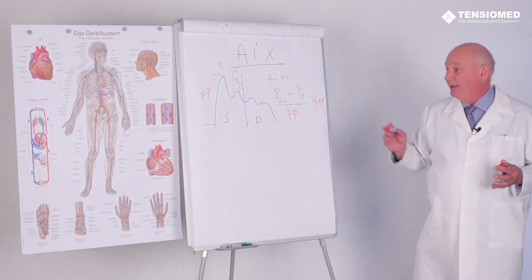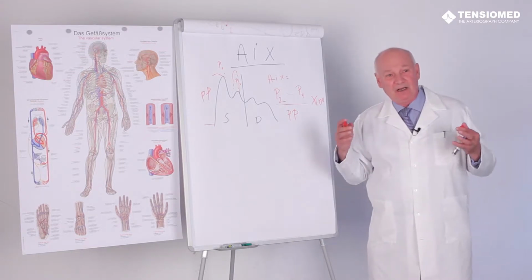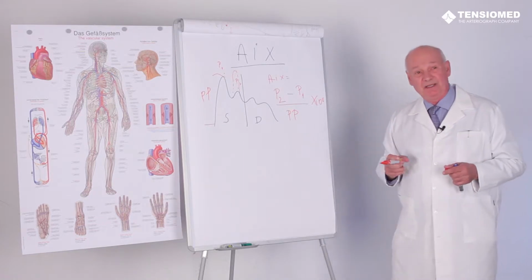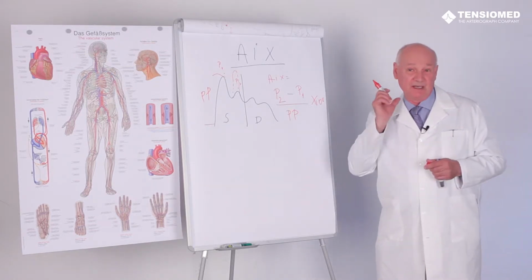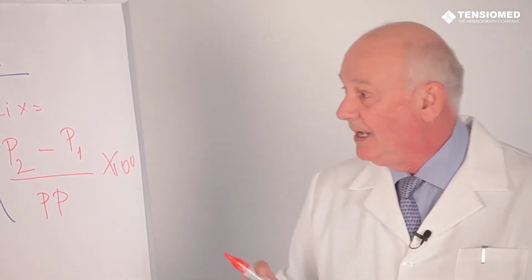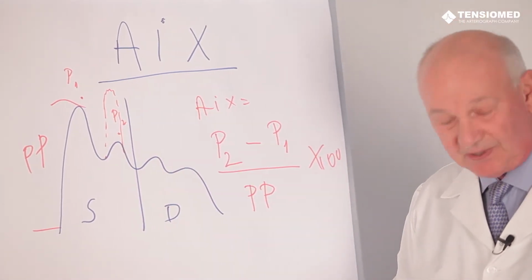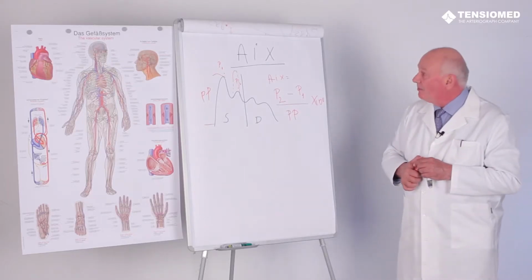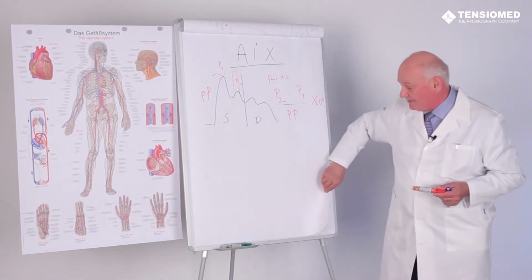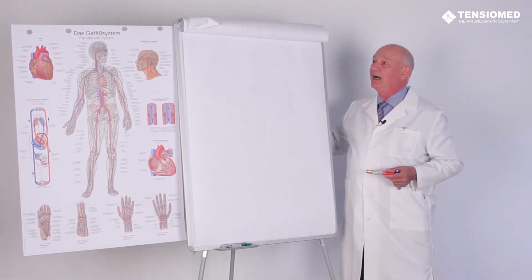The aortic augmentation index is very important, but in all of the large arteries and the medium arteries in the upper body, we can measure the augmentation index. We can measure it at the carotid side, the brachial side, or the radial side. Definitely, the reflected wave energy is the major determinant of the augmentation index. How does the augmentation index behave and change in different kinds of pathologies?